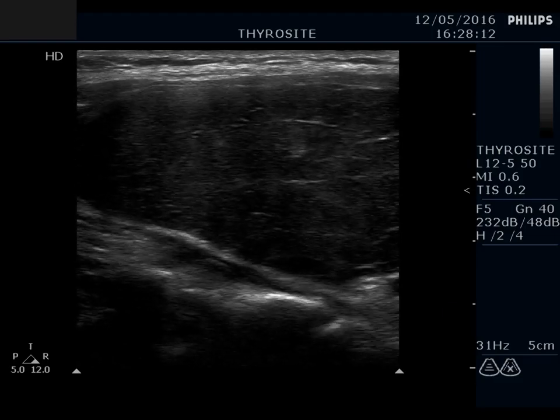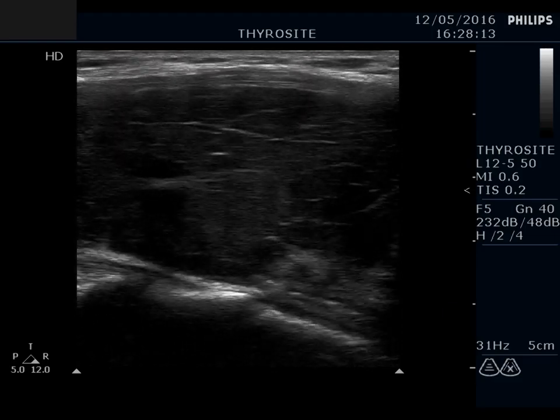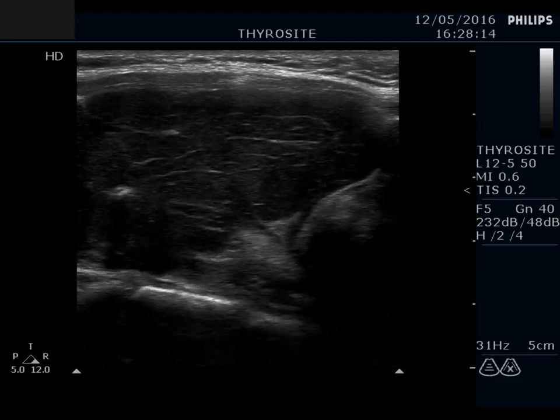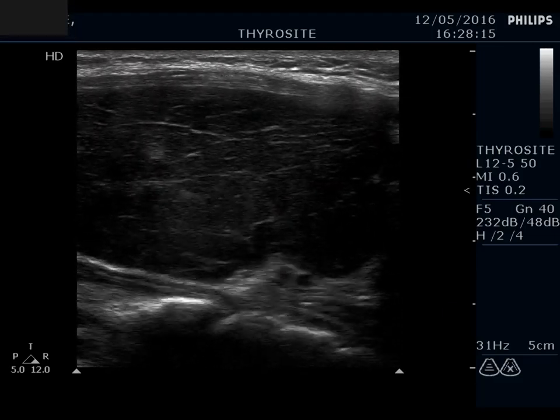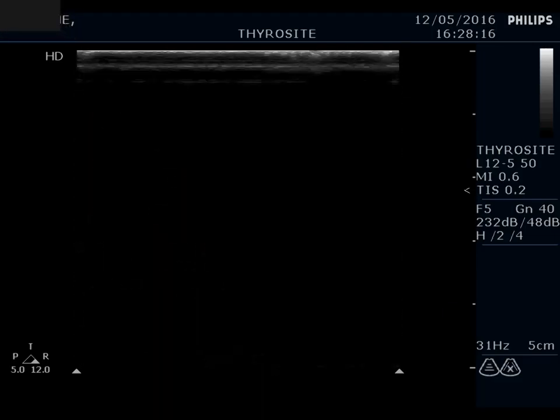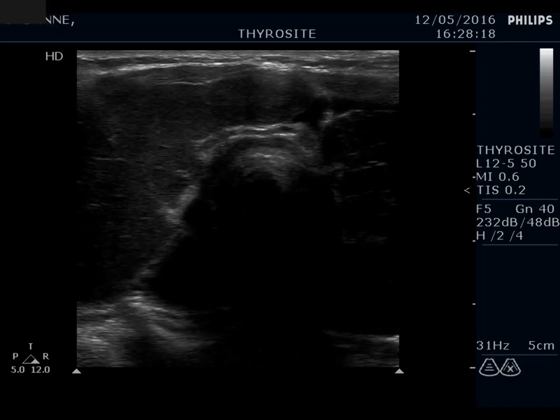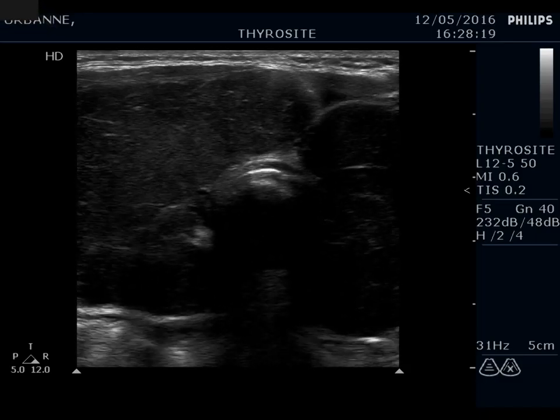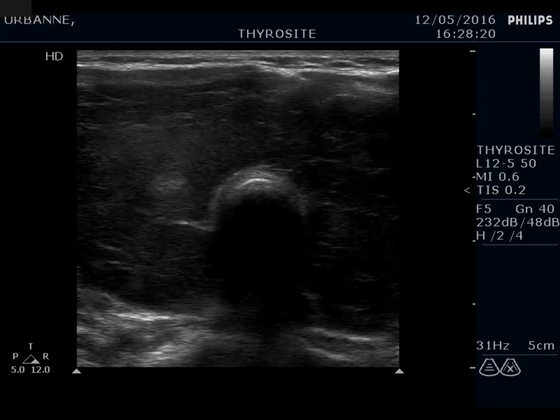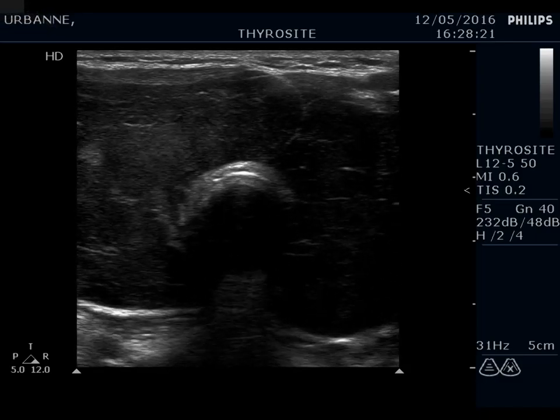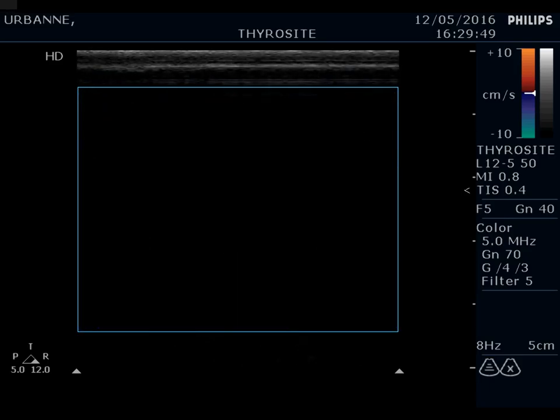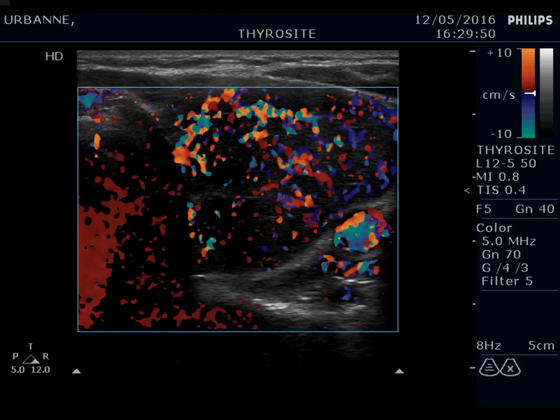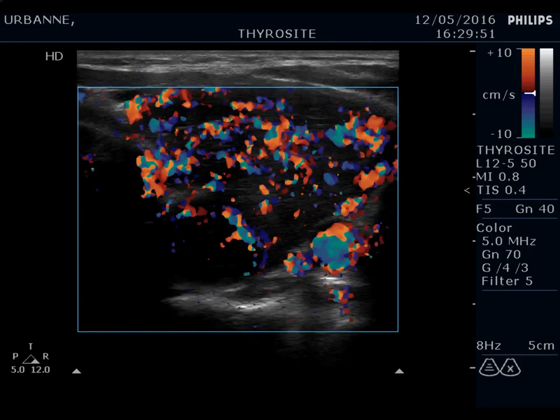The left lobe has a similar presentation. Note the echogenic lines and granules which correspond to connective tissue. The isthmus became wider. The vascularization is significantly increased.